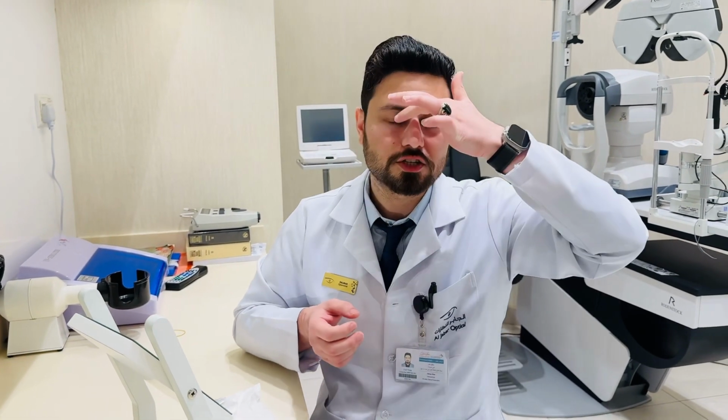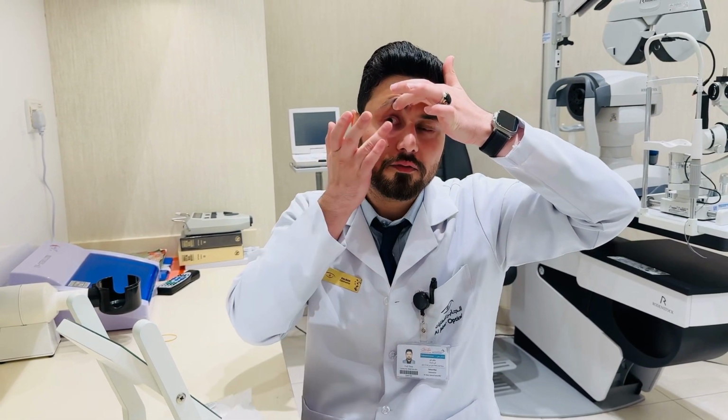See, you will just open your lid with this finger like this. Simply you can pinch on the corner.